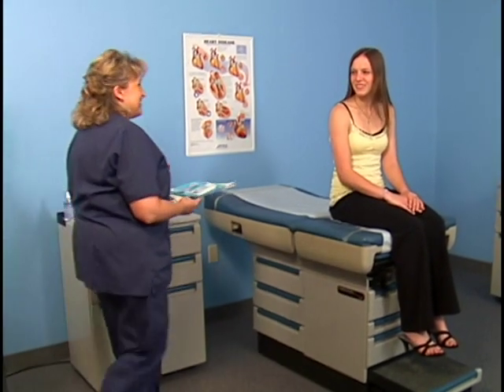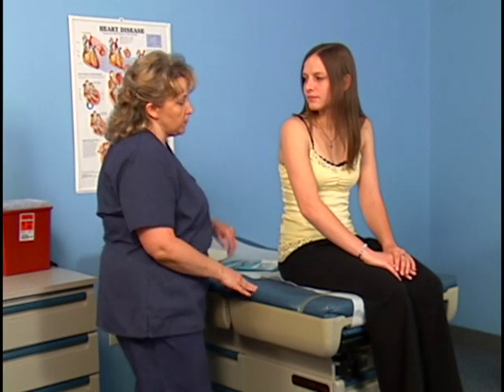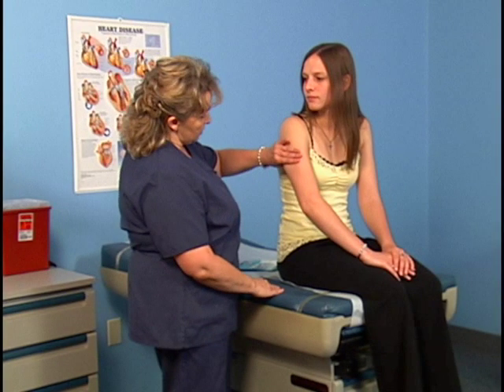Hi, I'm Diana. Hello. Identify the patient by full name and date of birth. Explain the procedure and purpose of the injection. You're in for an allergy injection today, right? Yeah. Okay. And you've been getting these about 2-3 months now? Yeah. Select an appropriate subcutaneous injection site.